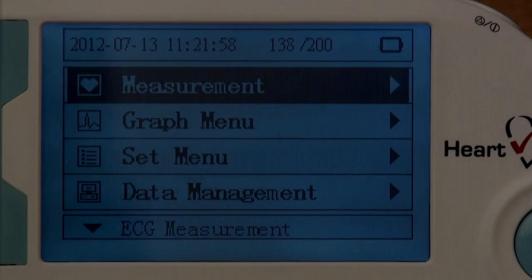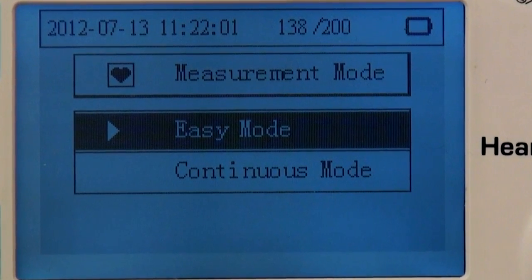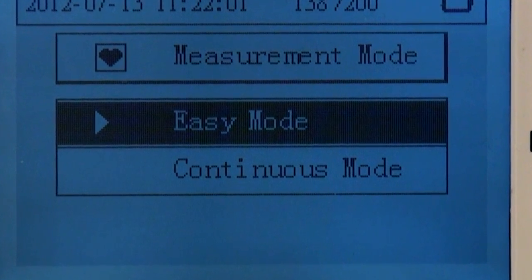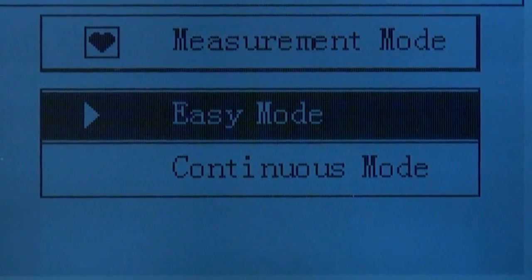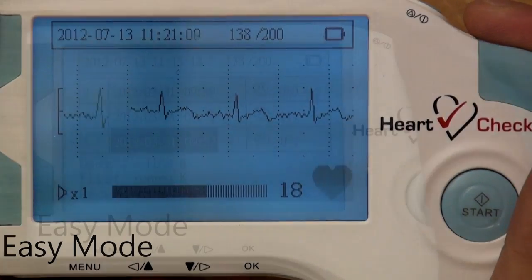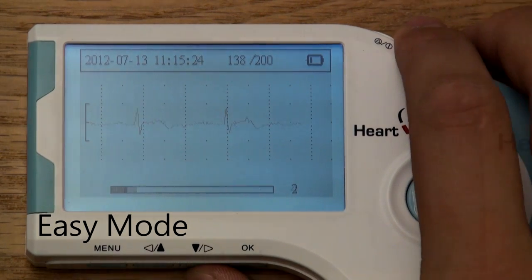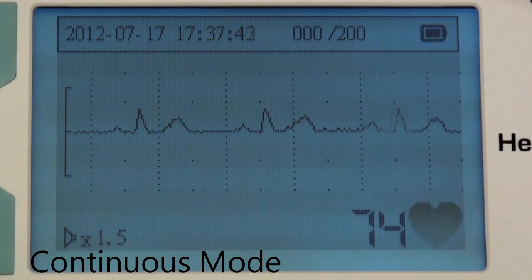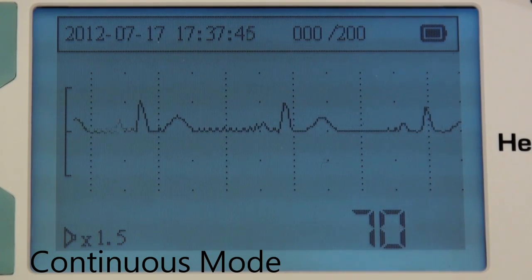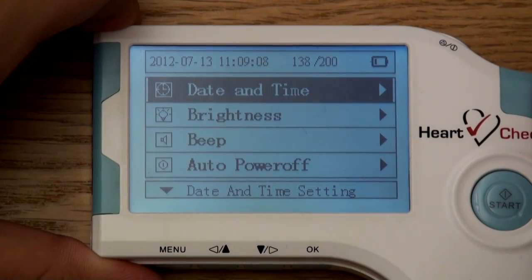Easy versus continuous mode. Before using the device to take readings, ensure the device is set to easy mode. From the main menu, scroll to the measurements category and select OK. Once in the measurements category, there are two options: easy mode and continuous mode. In easy mode, the device is ready to take and store up to 200 30-second ECG readings, which can be viewed, stored, or uploaded at a later time. In continuous mode, the device will only show a real-time continuous ECG and will not save the ECGs onto the device. Press the menu button to return to the previous screen.